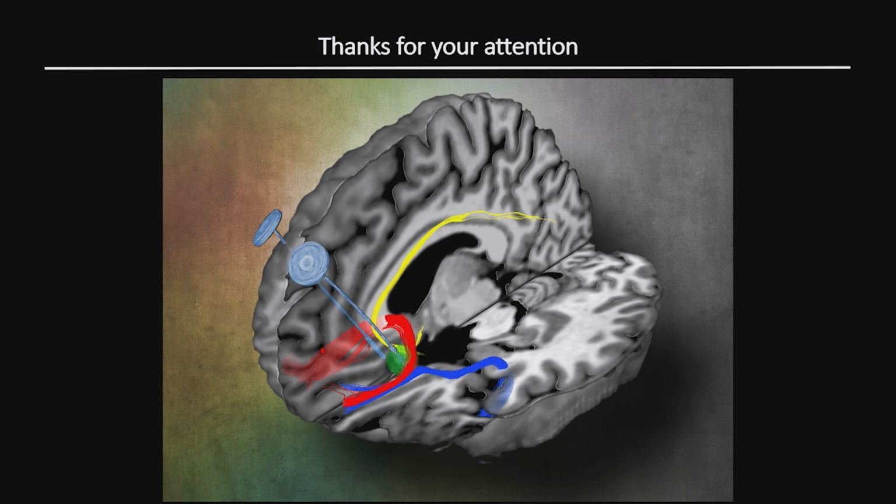All of our diffusion tractography-based targeting, which we developed using depression, OCD, or essential tremor, first starts from the anatomical constraint. For instance, the ALIC starts around the nucleus accumbens, ventral striatum area, and we keep moving posterior to see the GPe coming up. It really depends on the subject, but in around 80% of our targeting cases, it only gives us one spot.